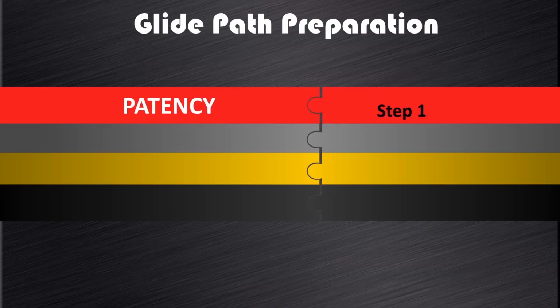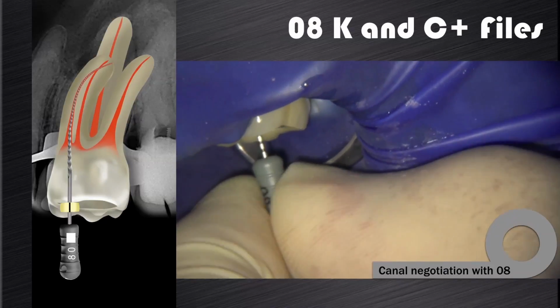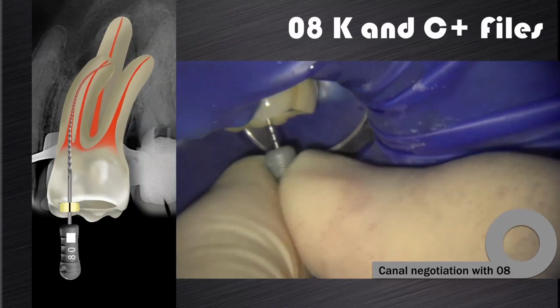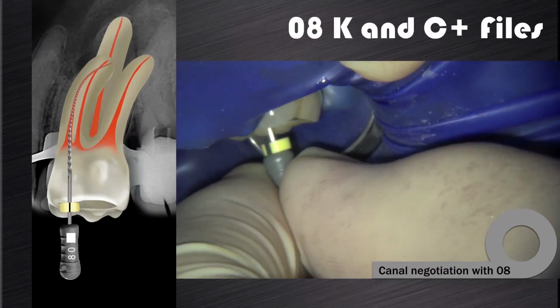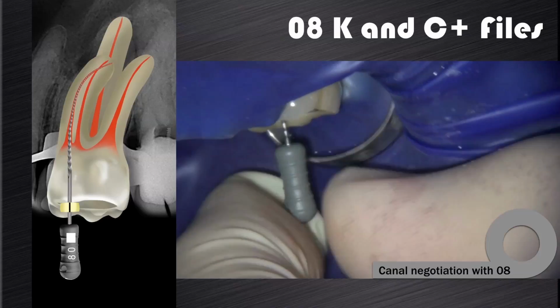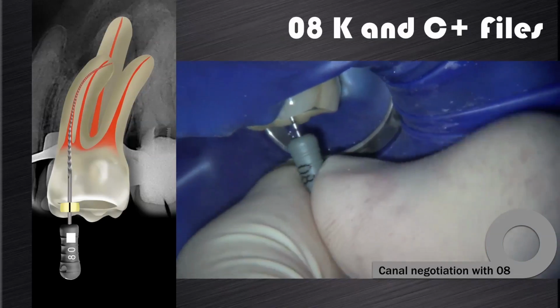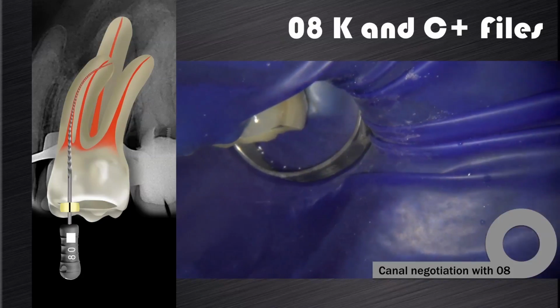As mentioned before, canal patency is the first step. I use a combination of 08C+ and 08K files to negotiate the canals to patency. Some cases are easy and some cases are very difficult. I think that the inability to create patency to full working length is often the reason why we see so many poorly prepared and obturated root canal systems.